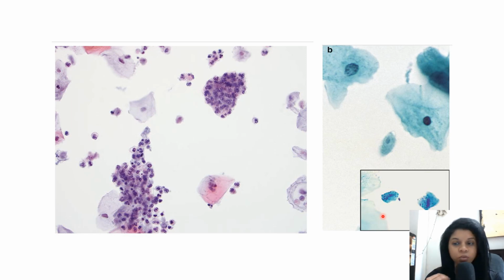See, it's different for every pathologist. They note the different characteristic features of a cell or an organism or a disease in particular. If I am seeing an eosinophil in a slide, I pick up the reddish granules first. That is what comes into my viewpoint, or my eyes catch that point very fast. But for others, it might be a bilobed nucleus or the spectacle-shaped nucleus. And for others, it might even be the size of the cell. So there are different things that different people note. This is the same for pathologists also.